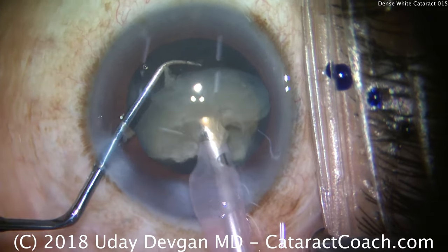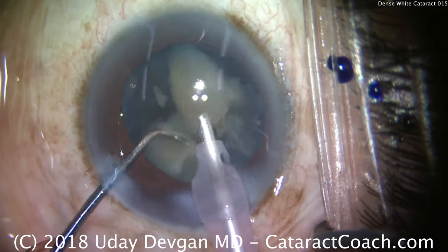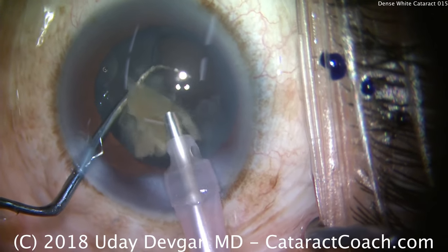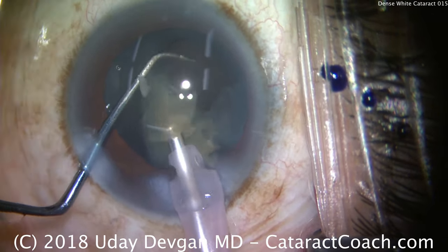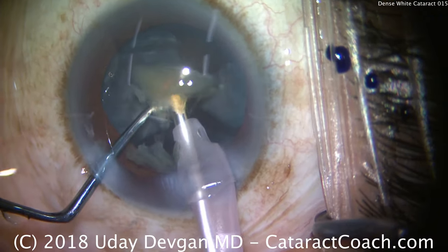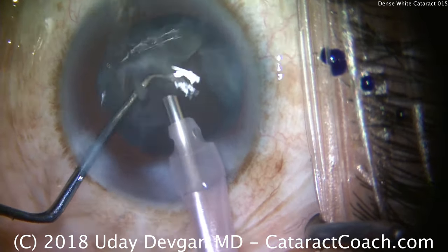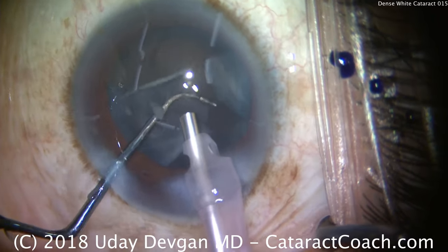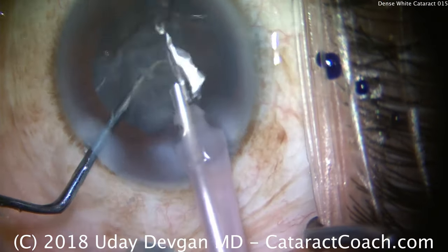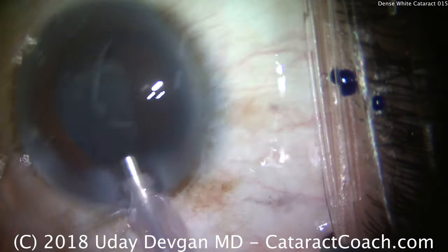Half the nucleus is out. Here's the other half — let's see if we can get the chopper around it. And that's a pretty good chop, but it's still kind of stuck together. Again, the nature of these types of cataracts. A little more buzz of energy here. The chopper's gone into a safe position to protect the posterior capsule — the smooth end of the chopper is towards the capsule. We'll take these pieces out; they'll come to the tip based on the fluidic settings in the eye. Don't chase the pieces, let them come to you. If there's some epinucleus, let's just do it with the IA probe — it's safer.